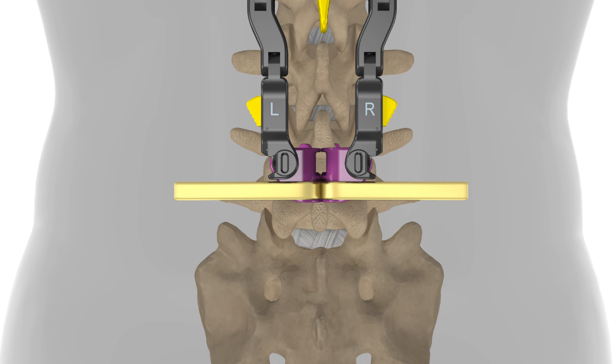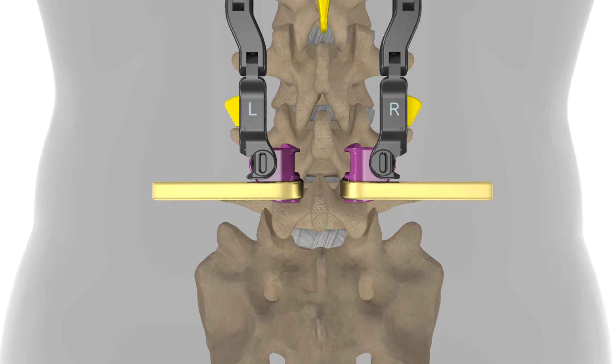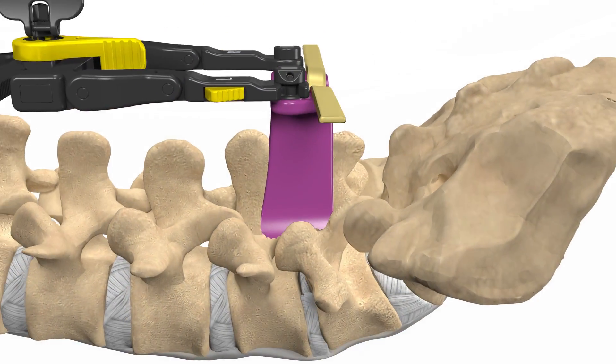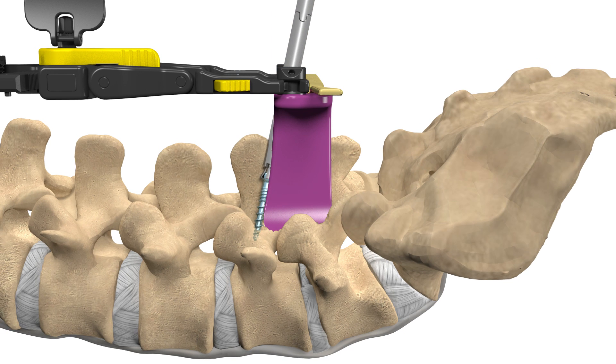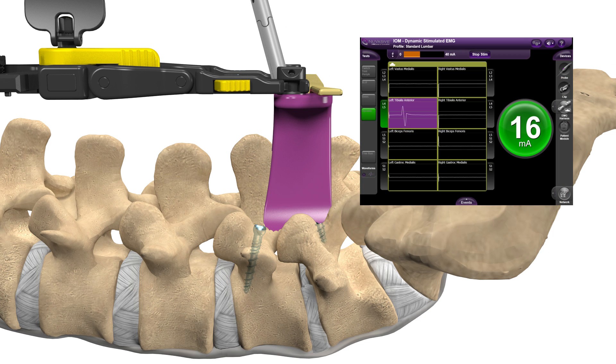A retractor will be used to provide your surgeon direct access to the affected area. Your surgeon will then place screws into the vertebrae that will be utilized at the end of the procedure to provide fixation. Nerve monitoring can be used to monitor disturbances to nerves during spinal procedures.